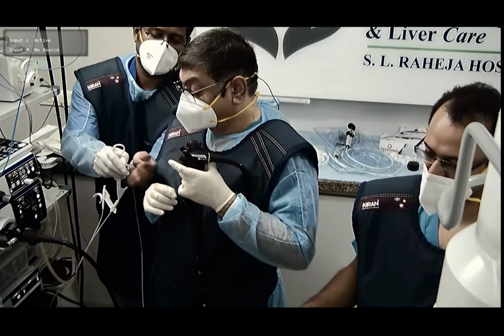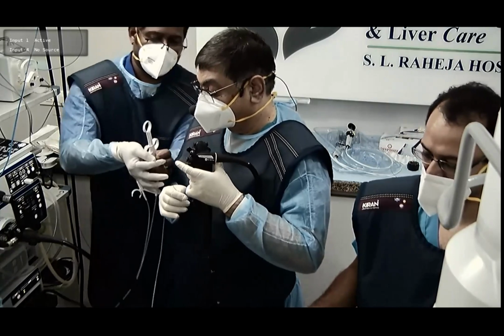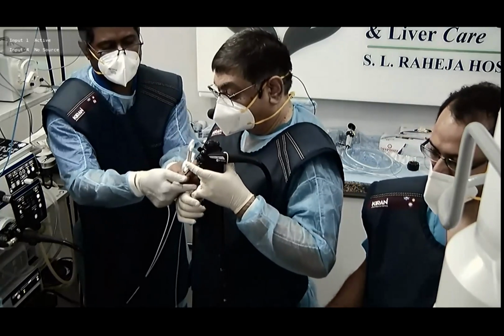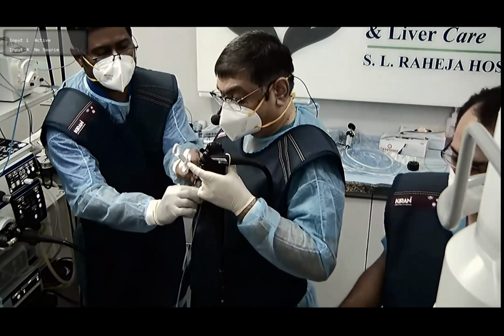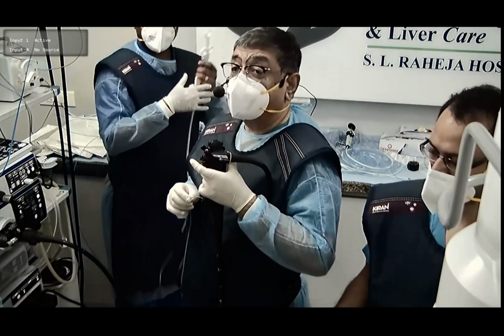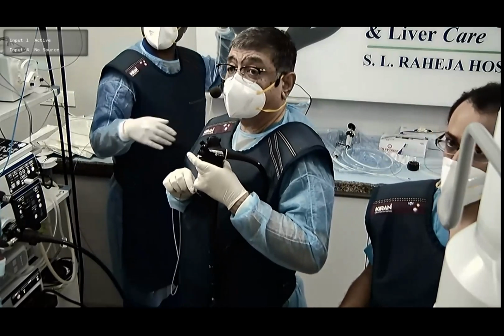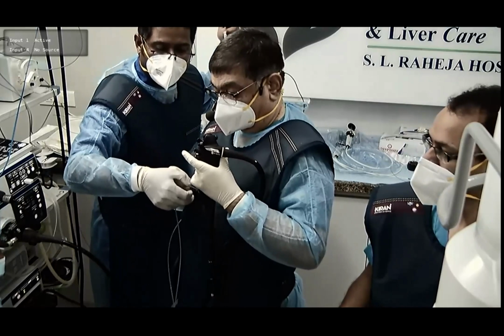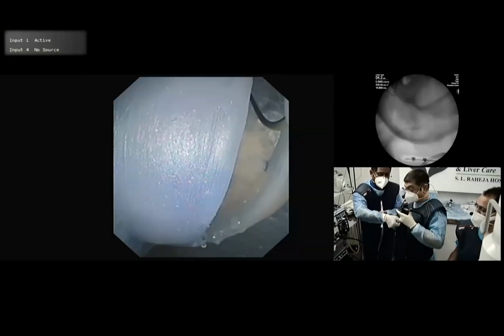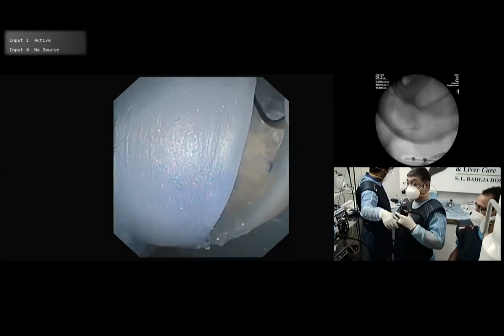One question. What if you pull too fast and the wire grasp slipped? How to troubleshoot it? Yeah, so if the wire goes, flush. Did you flush? Okay? No, it's going inside. Did you flush or not? Flush is most important. Flush. So with these hydrophilic wires, you need a lot of water.